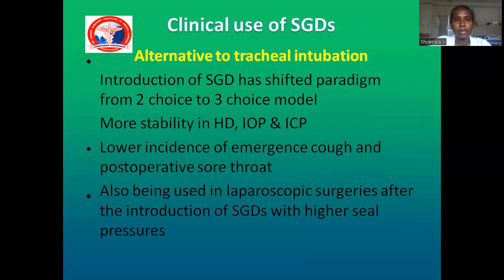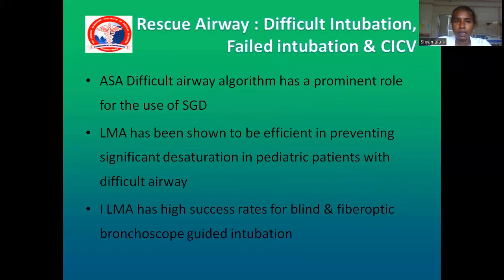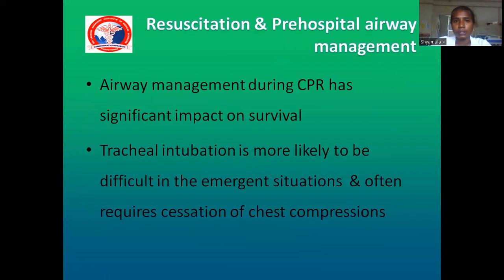So moving on to the main clinical uses. It can be used as an alternative to intubation and as a tracheal intubating aid. It can be used in rescuing the airway in case of difficult intubation, failed intubation, and the can't intubate, can't ventilate situation. And also in resuscitation and pre-hospital management.